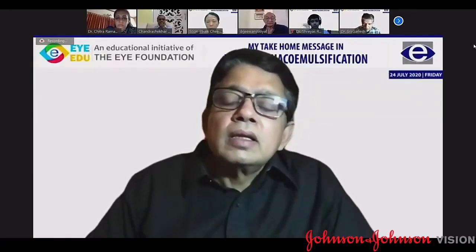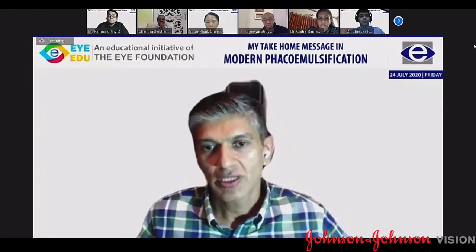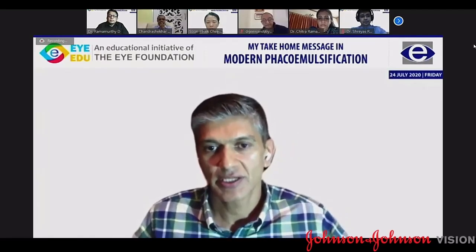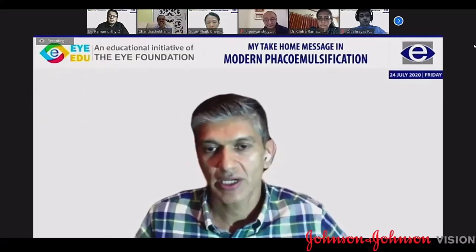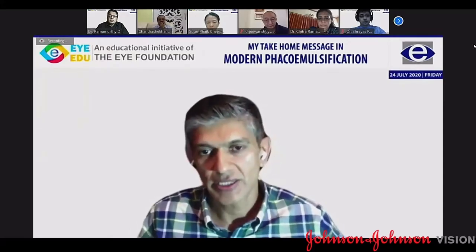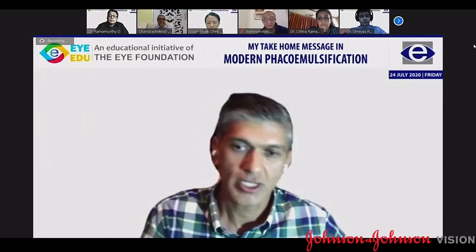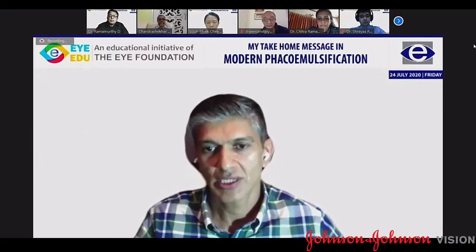Excellent. Thank you. Over to you, Sri. Yeah, one of the points I wanted to make is that routinely many of us use the optical biometers and take the K readings and axial length and do the calculation. Sometimes in a mature cataract or evident PSC, we are not able to get the axial length. So we do the immersion biometry, take the axial length, and put it into the IOL Master or Lenstar to do the calculation.